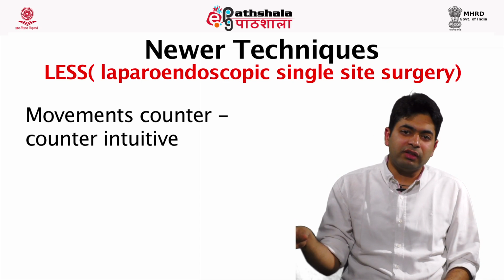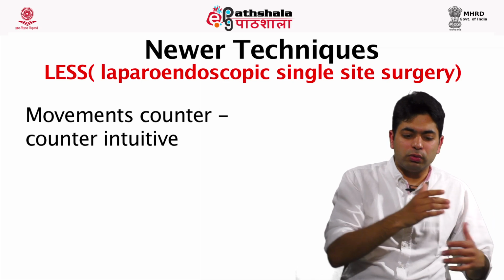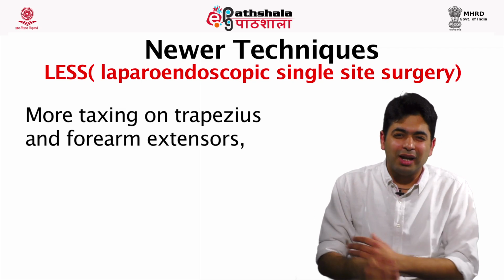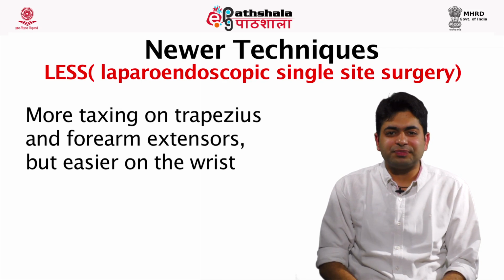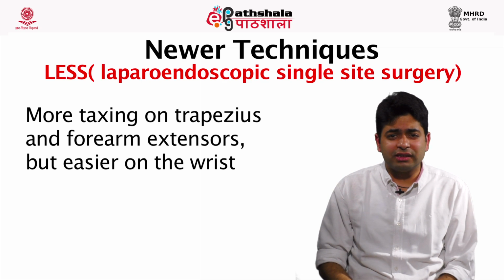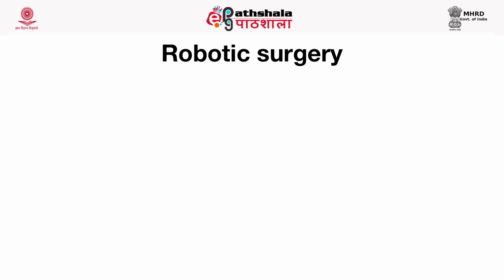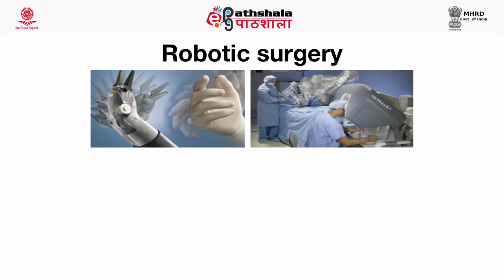Also, it has been seen with the help of the instrument that I discussed before to measure ergonomics, that it is more stressful for the trapezius, the arm muscles and the forearm muscles. But it has been seen that it is helpful for the wrist aspect. So in entirety, the new single site incision surgeries that have come up are more mentally and physically taxing for the surgeon.